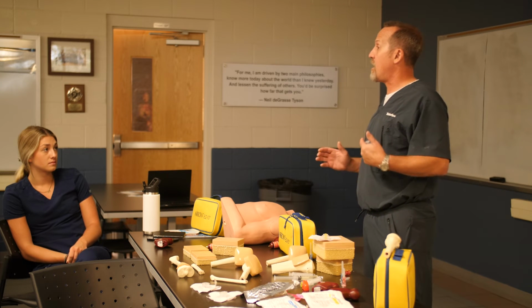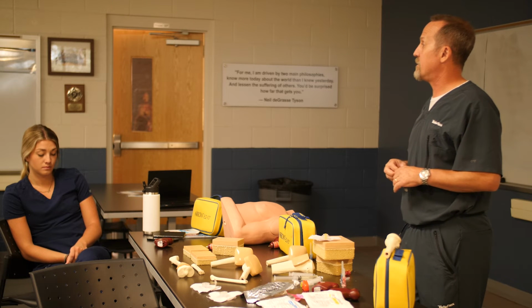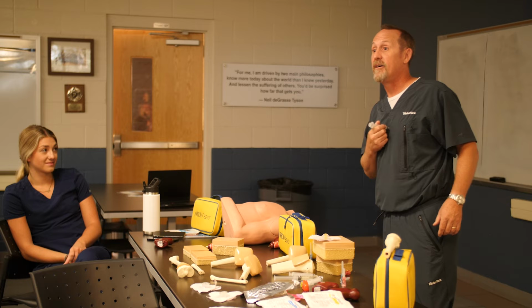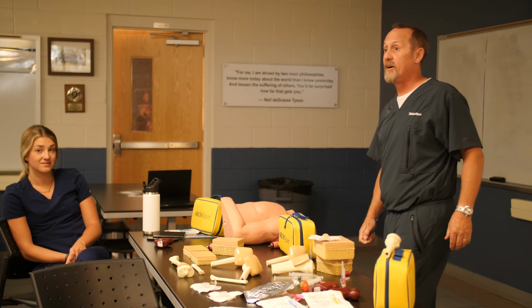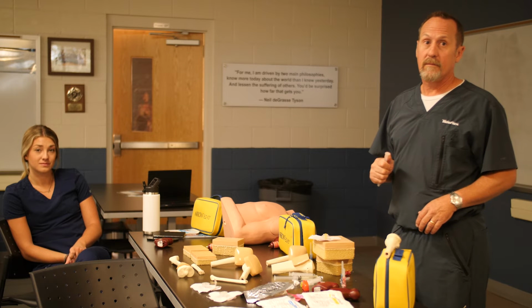With our product, it's contraindicated to be used in the sternum, so don't ever try to place one there. As I mentioned, as she mentioned, there's a lot of stuff underneath there that could be very, very dangerous if you go too deep.